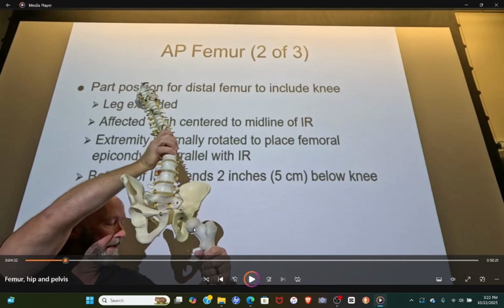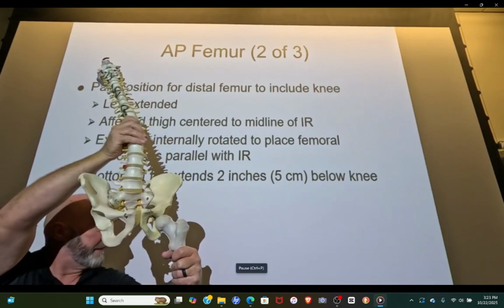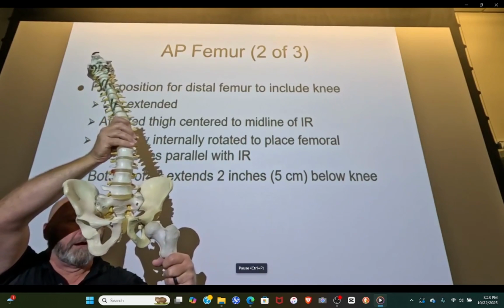So what I'm trying to work off of is the shadow that this would be projecting. With the shadow, I'm intentionally placing the femoral neck and head anterior to the acetabulum, trying to line the shadow up on the screen behind me. So I catch that I've got the wrong femur here, right about now, I think.